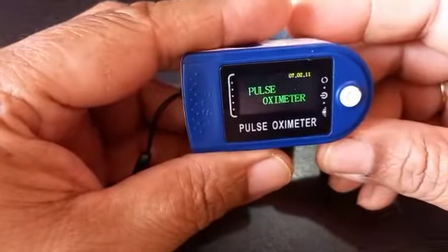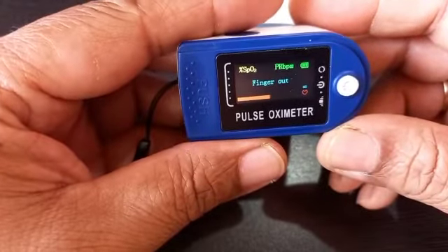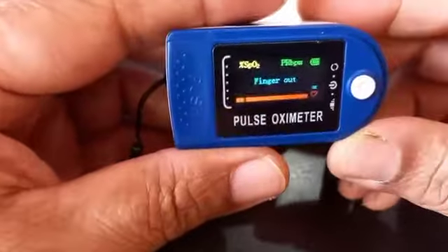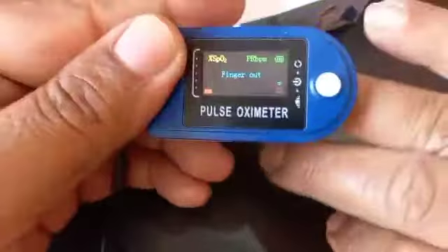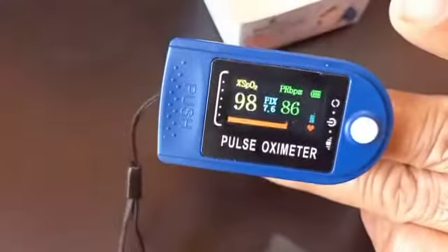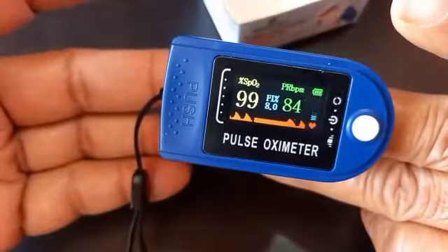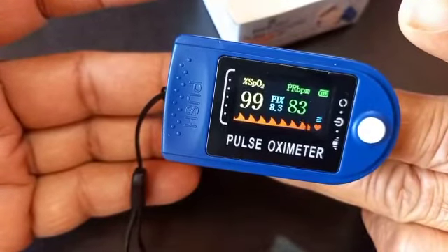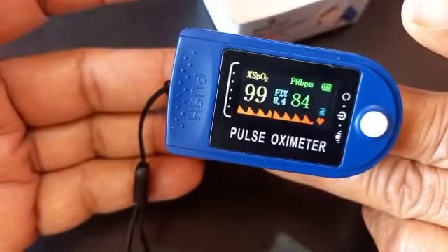Let me switch it on. See friends, it is working fine. I will show you the test result live. It is showing 'Finger out.' Okay, now I am going to insert my finger. Showing the result — the oxygen level is 99 and the pulse rate is 83. It is going good.